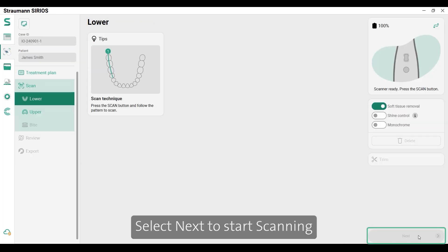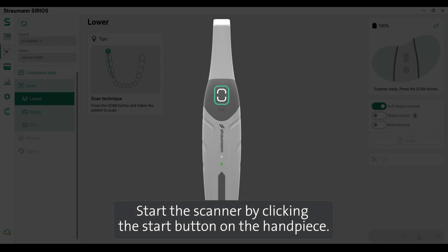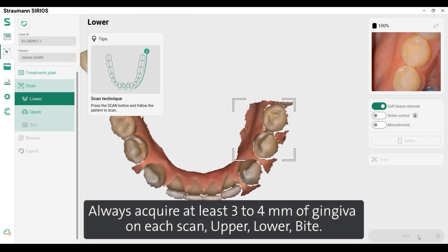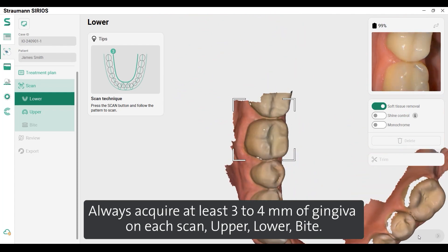Select Next to start scanning and follow the scan sequence, which can be edited in the settings. Start the scanner by clicking the Start button on the handpiece. Always acquire at least 3-4mm of gingiva on each scan — upper, lower, and bite.